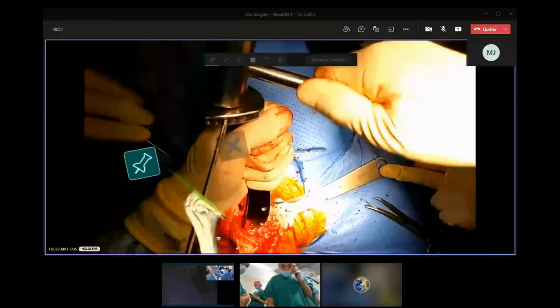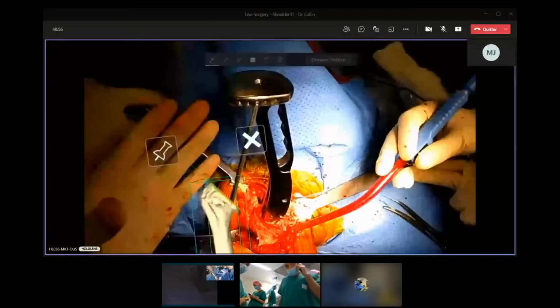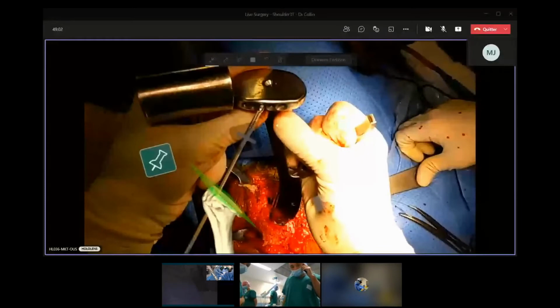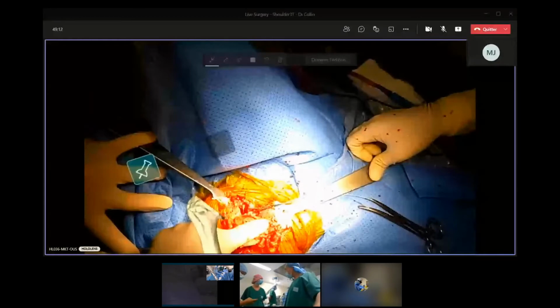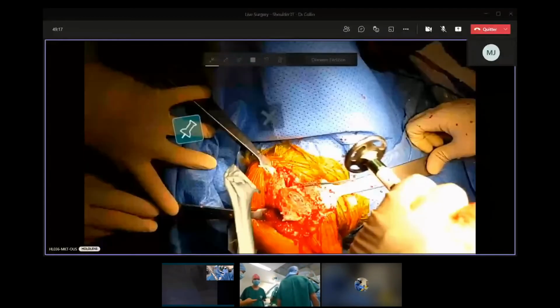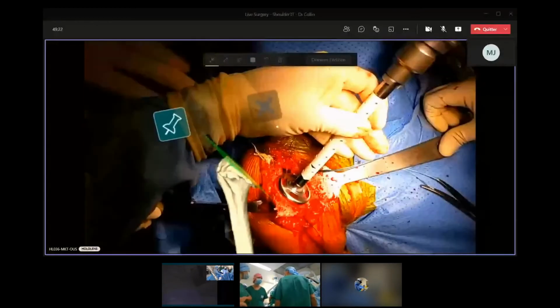the humerus on this old lady. That's perfect. That's good. Perhaps a bit more. Okay. So yes, we're going to rim a bit just to show to everybody that you can do that. If your retroversion is not perfect, you have a rimmer here, and you can adapt everything.